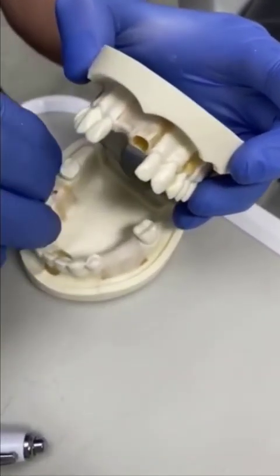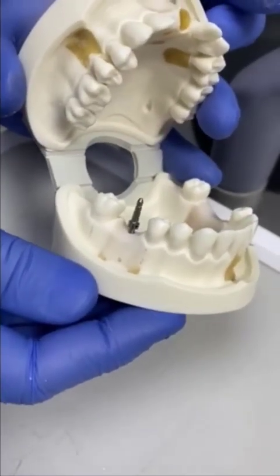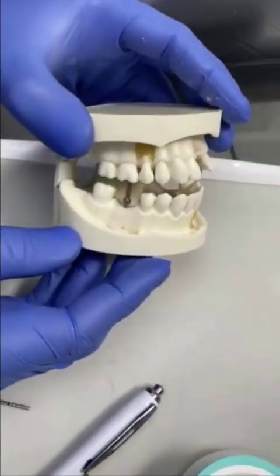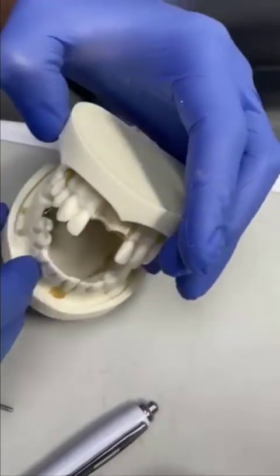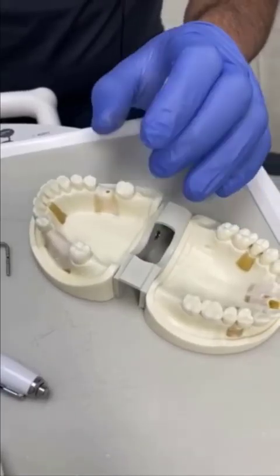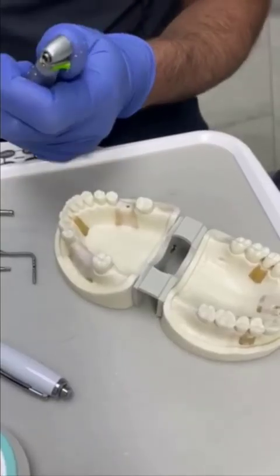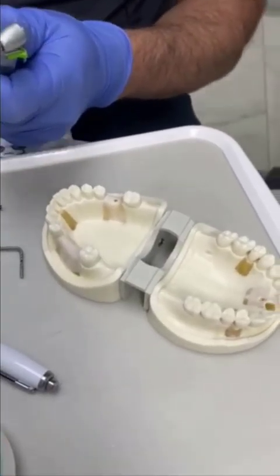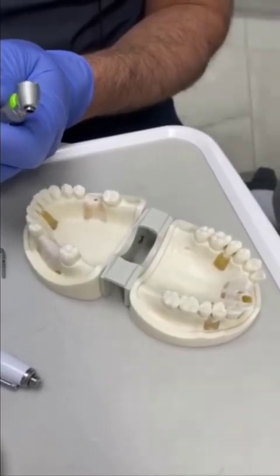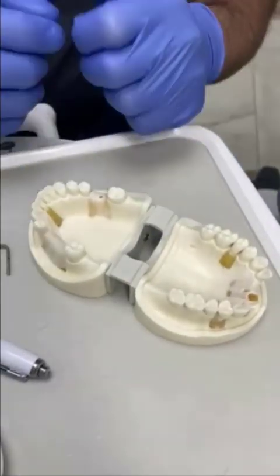You can also insert the depth gauge and take an x-ray to see what angle you are in relation to the roots of the neighboring teeth. There can be confusion with the angulation — do I align it with the roots of the neighboring teeth or not? Sometimes you need to take a view on that, because occasionally by aligning with the roots of the neighboring teeth you may end up with too great an inclination or angulation, which may make it difficult to insert the crown.